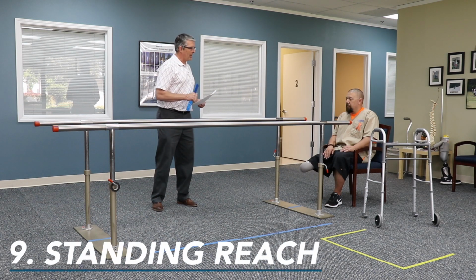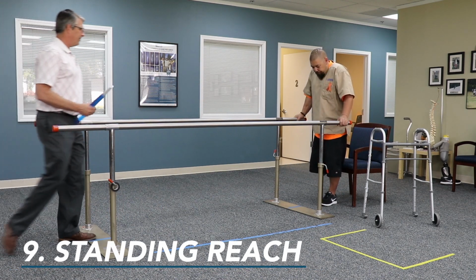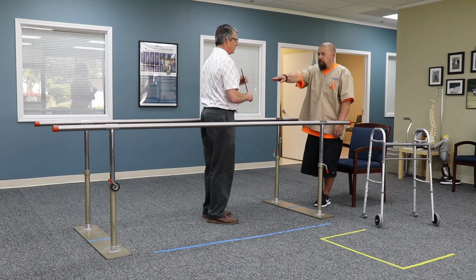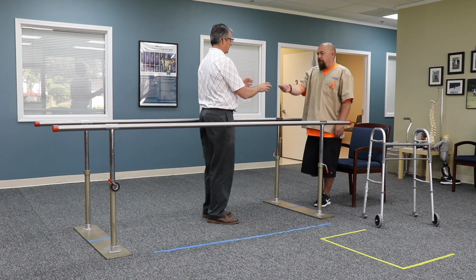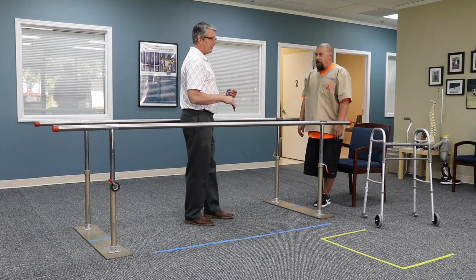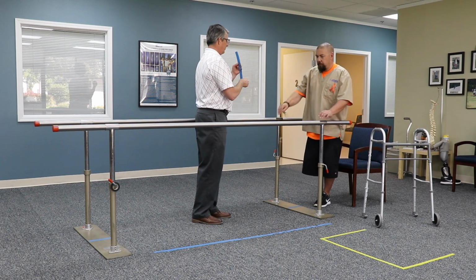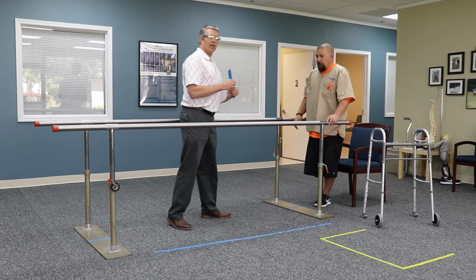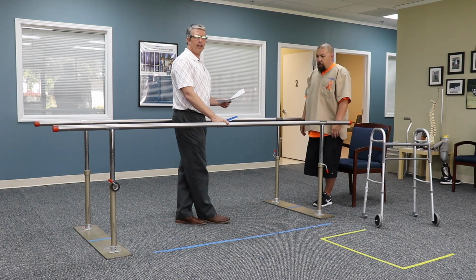All right, so standing reach is number 9. You have the patient stand up, and they're going to reach out and grab the ruler. Okay? Now he was successful in doing that, even without his prosthesis. Not every patient is going to be able to do that, so we'll demonstrate that. Okay. So that's what it might look like unsuccessfully. I had to use an assistive device. In this case, it's parallel bars.